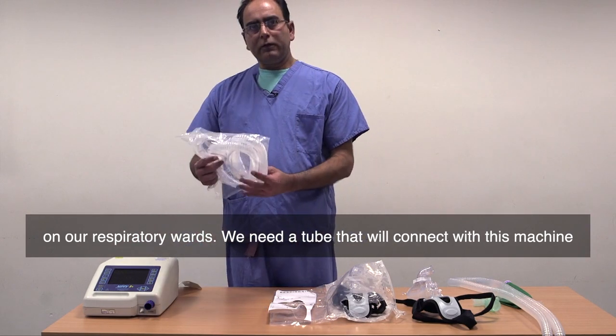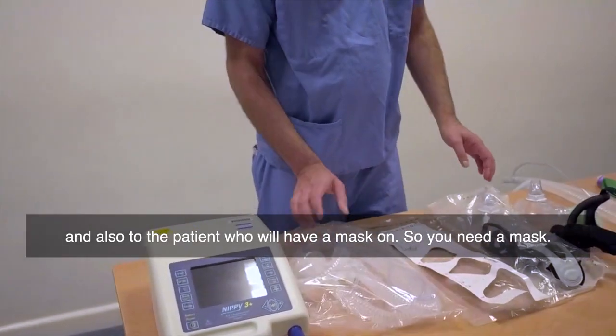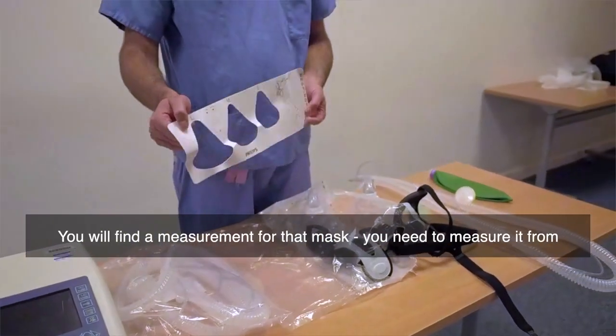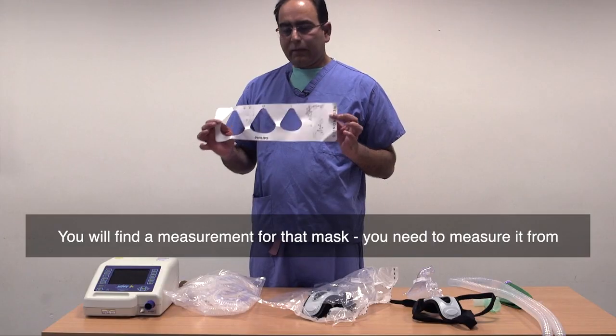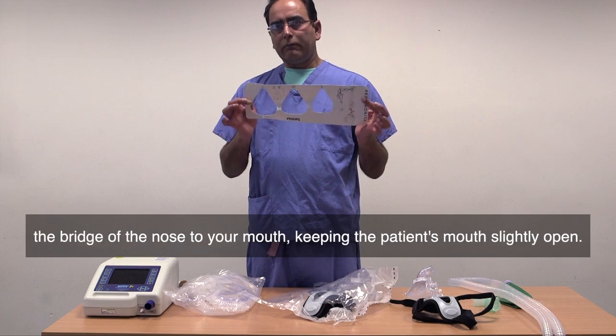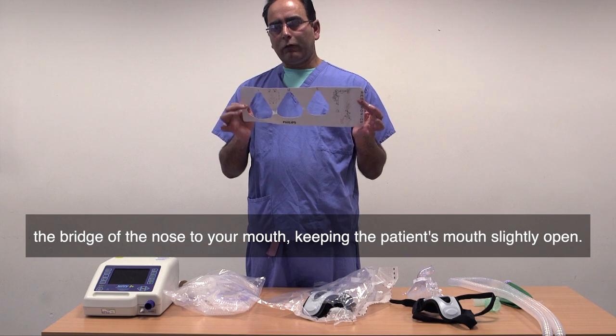You need a tube that will connect with this machine and also to the patient, who will have a mask on. So you need a mask. You will find a measurement for that mask — you need to measure it from the bridge of the nose to the mouth, keeping the patient's mouth slightly open.